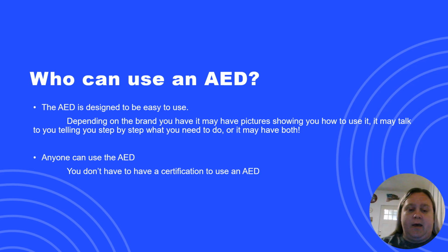It can make things so much easier and smoother if you can show up to a call and just slap it on and not pause and be like, oh my, this picture's kind of rubbed off a little bit, or maybe for some reason the voice part of your AED isn't working. I don't know. Things could happen. But even if all that is working, it could still make it smoother if you can just go and not pay attention to the pictures or the fact that it's talking to you.